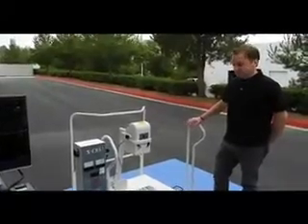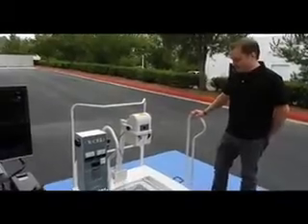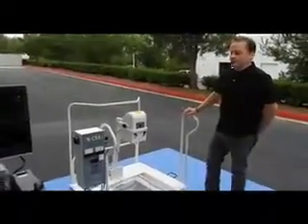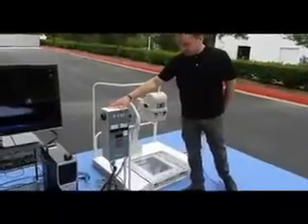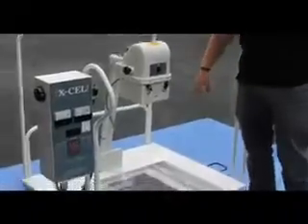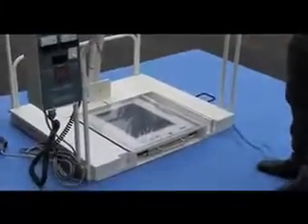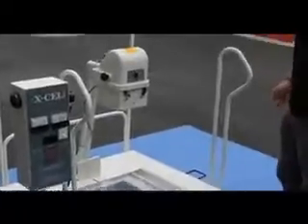You can buy the complete system, which is everything you see here, plus computers on the digital side. Or you could also do a retrofit, which is using an existing generator — this box here — and an existing tube, and putting it onto a new platform with the DR, acquisition laptop, and a PAC system. What's shown here is the retrofit.